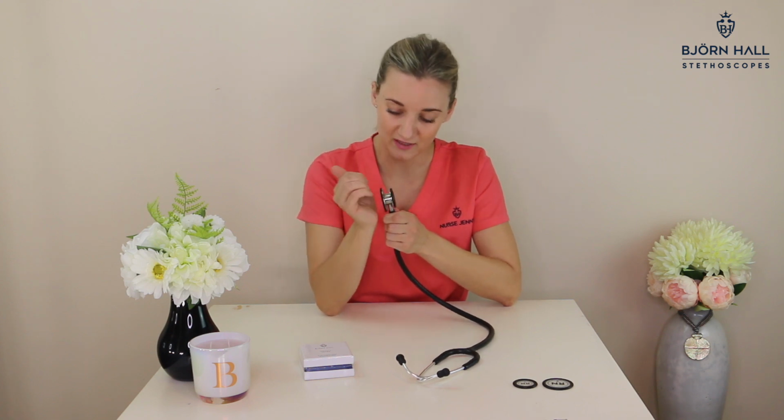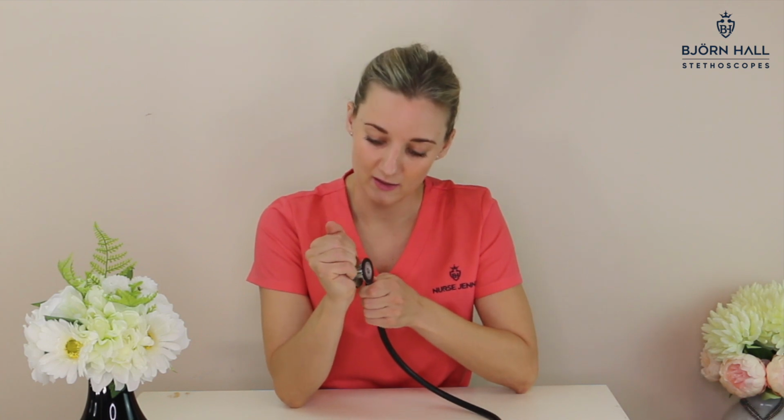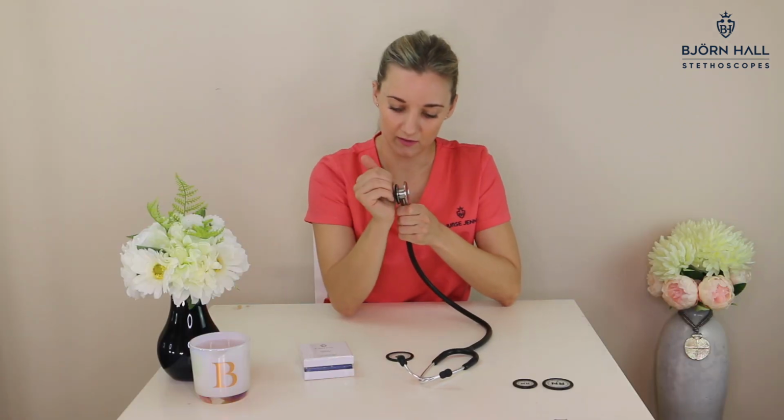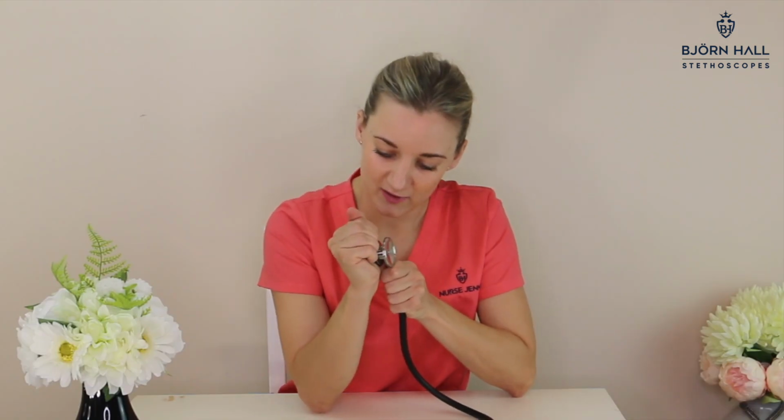Now I can get 4 fingers on, some people can only get 3. So however many fingers you can get in there with your nails, you push in and off, get the little ledge and remove it, just like that. Do the same with the small one, get your fingers in, actually I can only get 3 on the small one. Get 3 fingers in, push off, just like that.